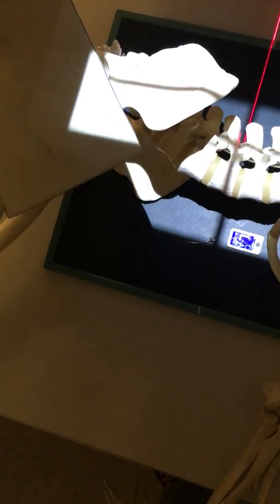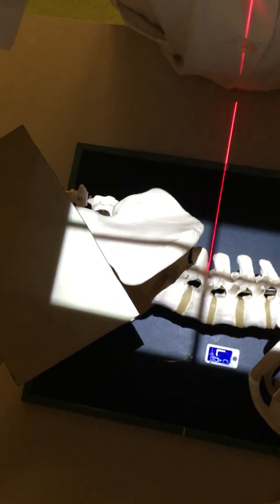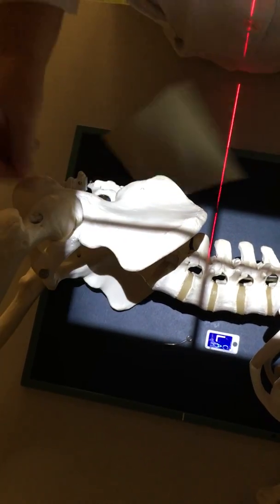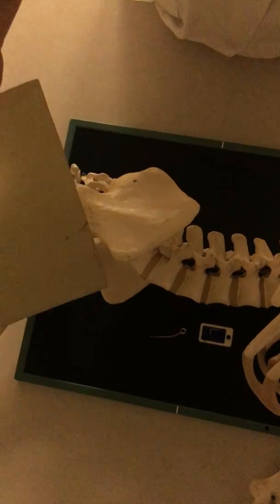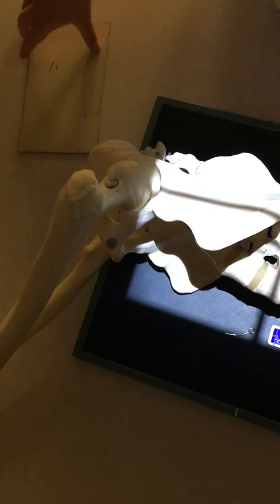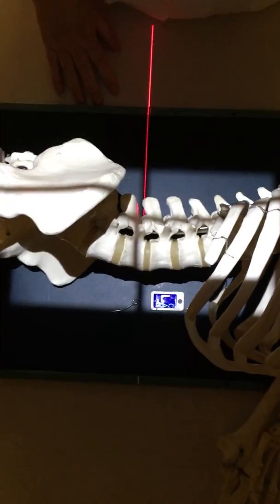If you're going to shield, you want to place the shield, this would be shielding for a female, from the ASIS back toward the coccyx like this. If you placed your marker down here in this general vicinity, your marker would not show if you are shielding your patient, and you should be shielding your patient. That's it.